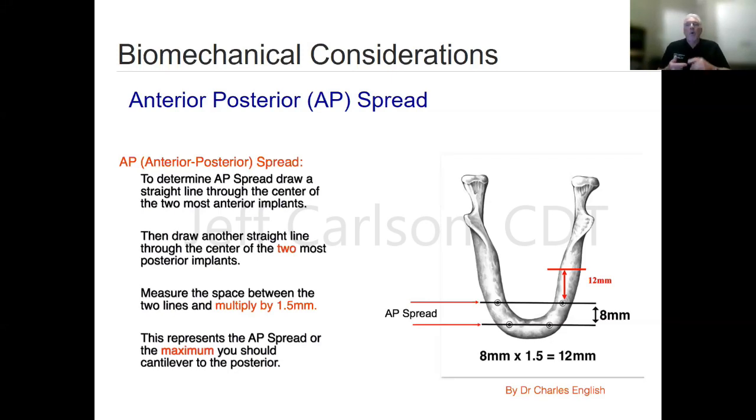You have to look at what's the opposing dentition, what's the musculature like, how wide is that implant, how long is that implant, what's the quality of bone, and again, I think I said parafunction already. So it's a guideline. It's not just a hard, fast rule.